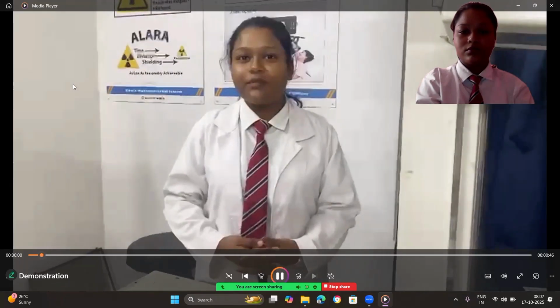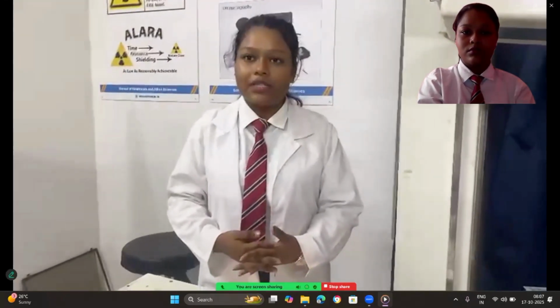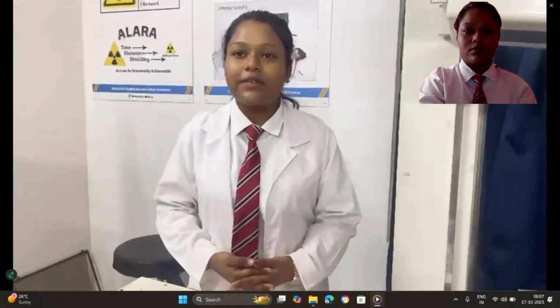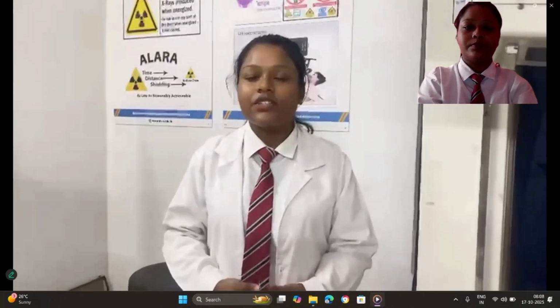Hello everyone, myself Aditya Sultana. Today I explain pelvic X-ray for a suspected hip fracture. Pelvic X-ray is essential to detect fracture, guide treatment and monitor healing. Proper positioning and technique ensure clear imaging.